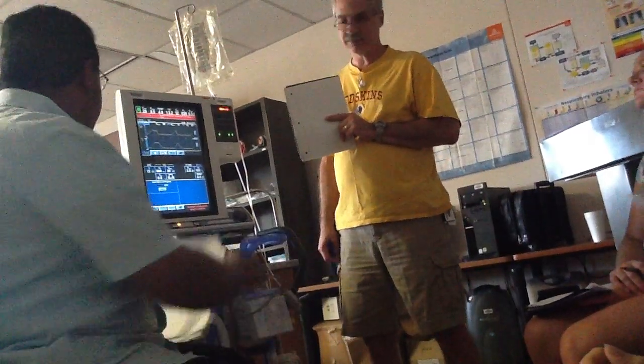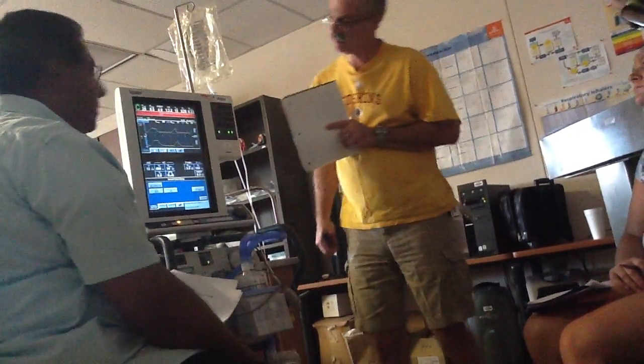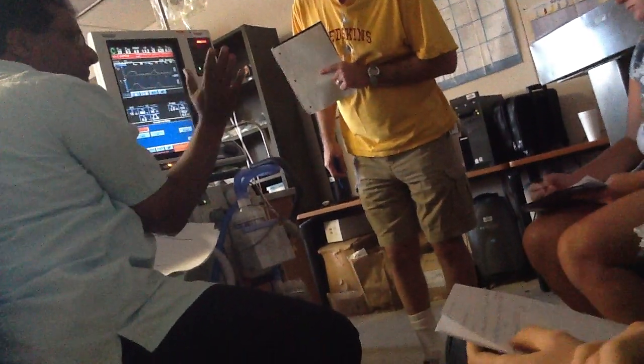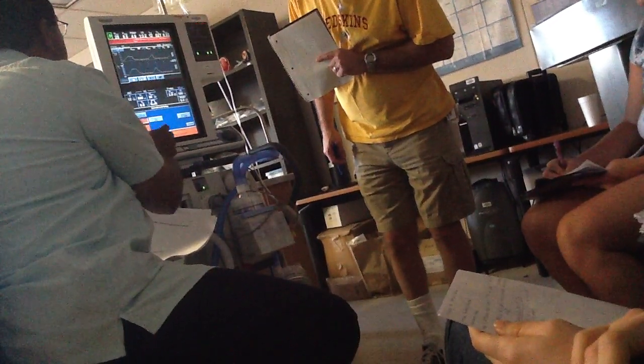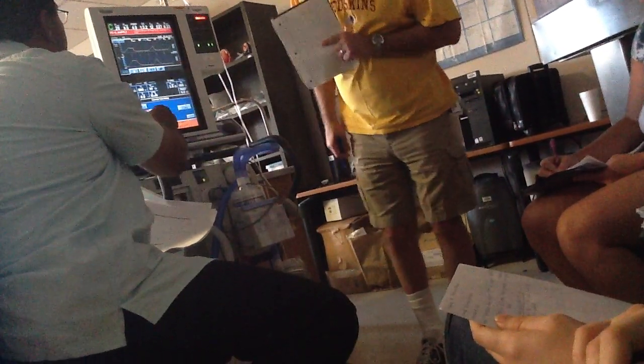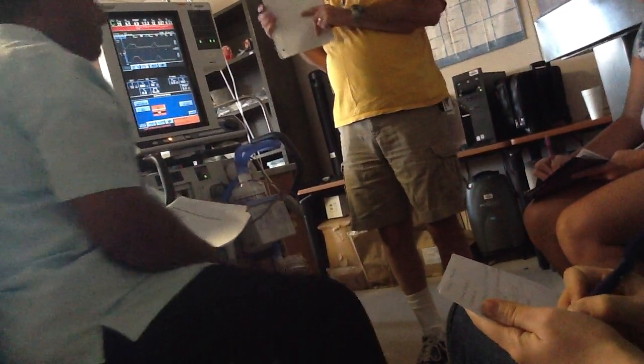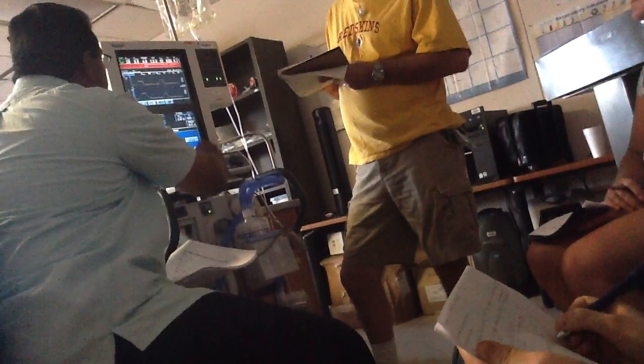Okay, let's go to the vent setup. Now you're going to do the invasive, and your mode should still be assist control. And your mandatory type is going to be PC. So turn that to PC, pressure control. And whenever you have pressure control, you want the trigger type to be pressure trigger. It's already on pressure trigger. And now accept. Continue.